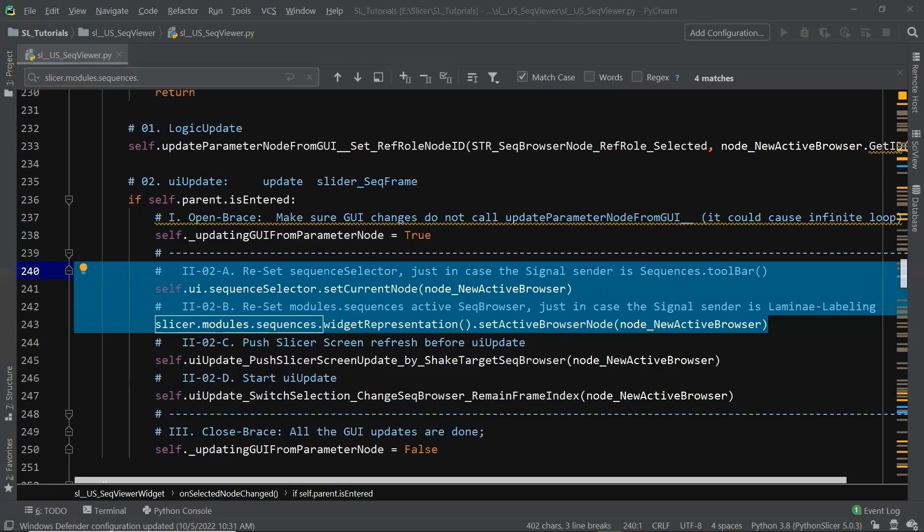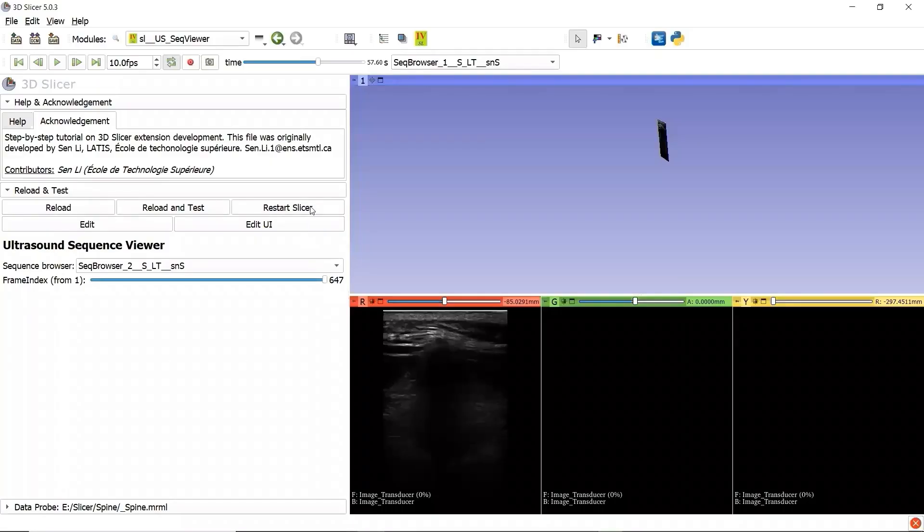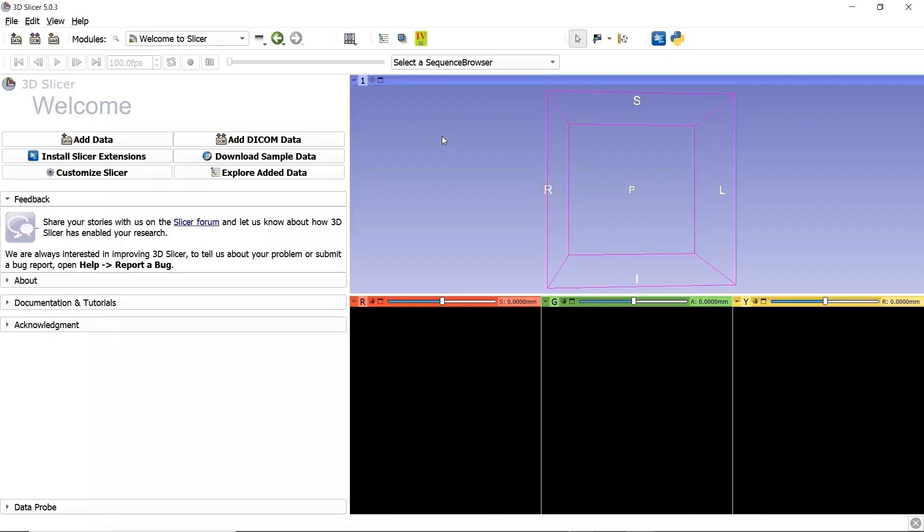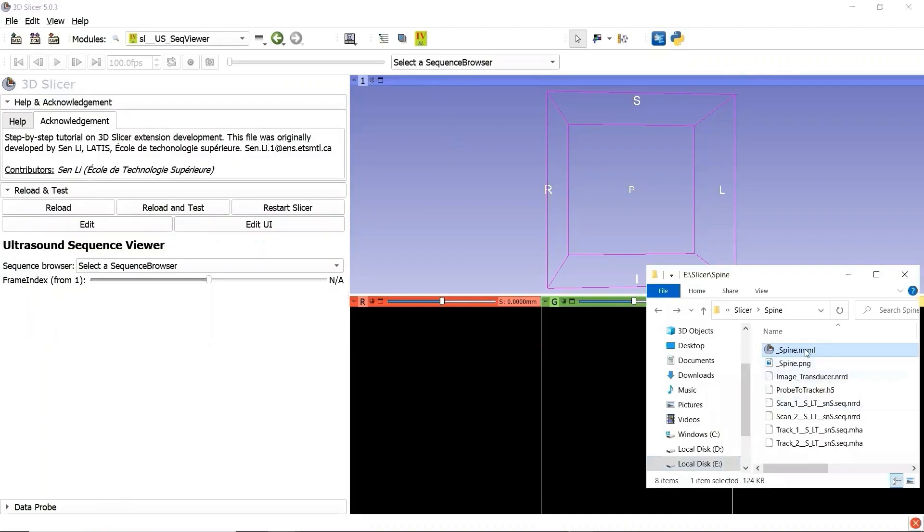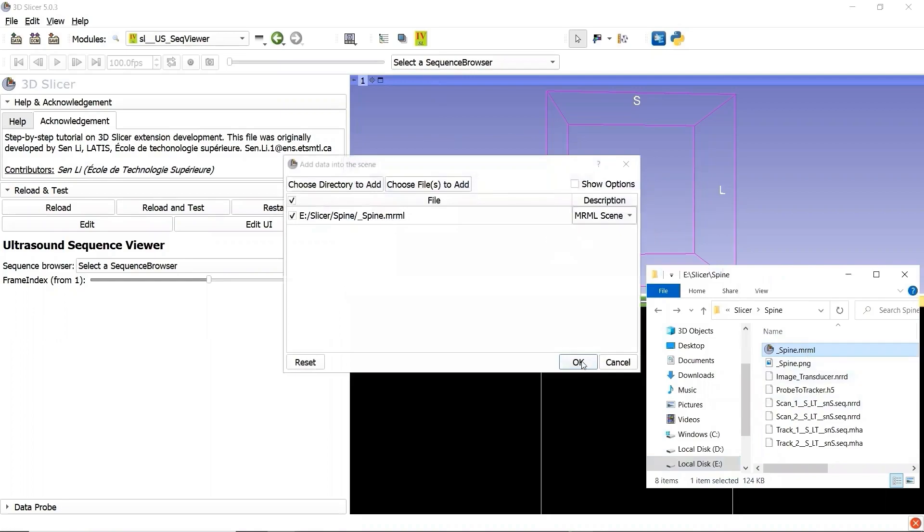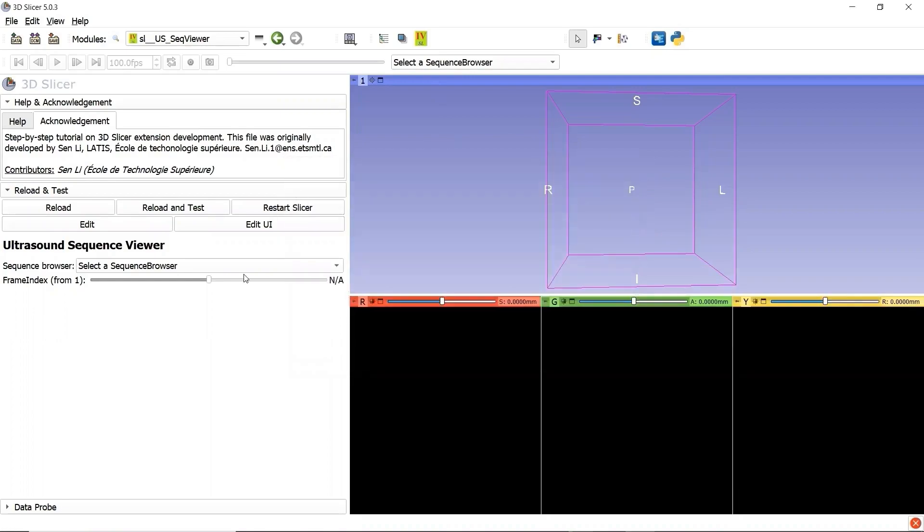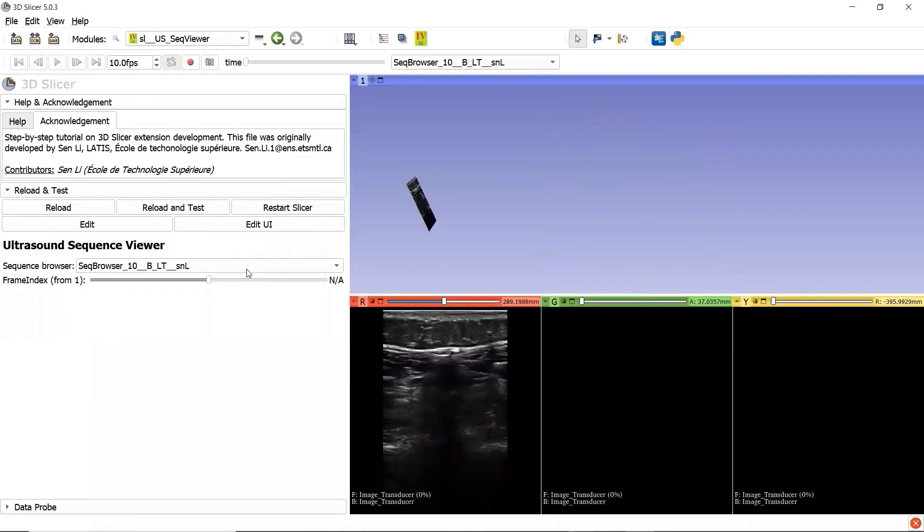We go to our module, open the sequence file folder, drag the sequence file to 3D slicer, and check if the two Sequence Viewers are really synchronized.